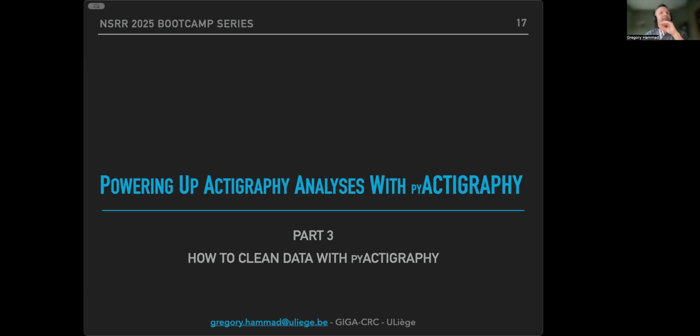least sexy part of any analysis. But yet, this is most likely the most useful one. I hope at the end of this tutorial, I will basically succeed in convincing you that it is really, really important, and because we'll see that it might impact the metric that you're going to calculate. So that's really a crucial part. That's the most boring part, but that's the most crucial part.